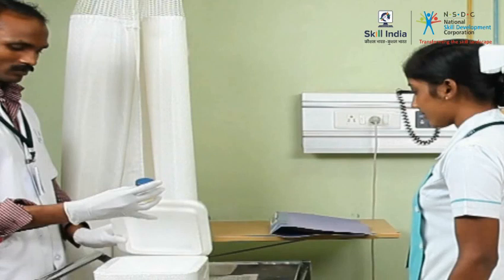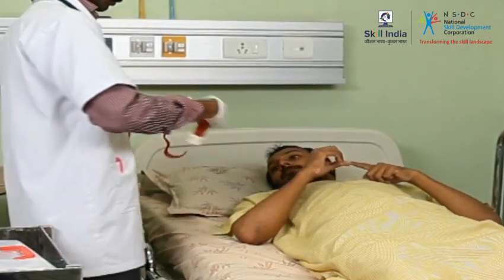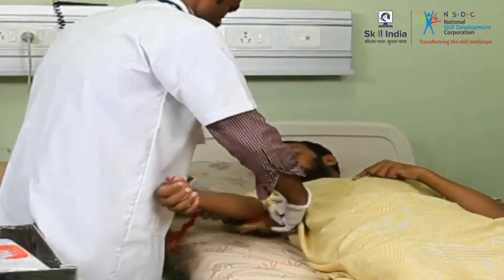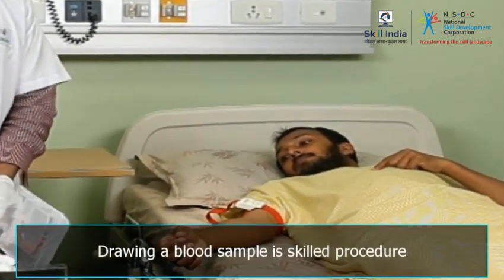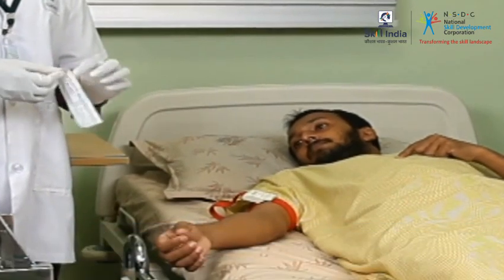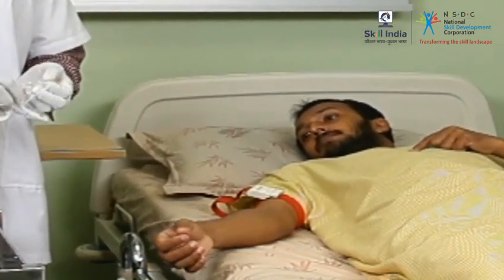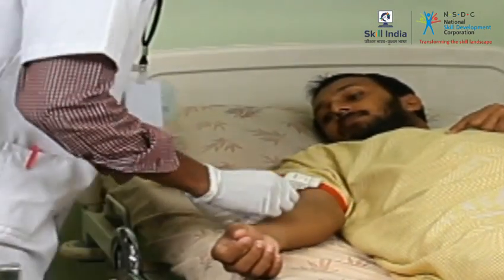Collection of specimens. The procedures that need to be carried out for collecting the specimens from the patients vary according to the type of the specimen that is collected. Blood specimen collection is performed routinely to obtain blood for laboratory testing. Blood is most frequently obtained via a peripheral vein puncture. Drawing a blood sample and collecting the same for testing is a skilled procedure and is often carried out by a nurse. Based on the amount of blood needed for testing, the sample is collected from the vein or by needle prick.